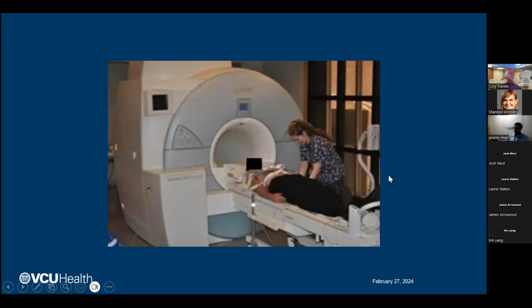And this goes for a number of things. I mean, not just CMR, but transthoracic echocardiography, right heart catheterization, all these things where traditionally the measurements have been made at rest. And I think what's become clear with other modalities, including right heart catheterization, is that you can fail to uncover certain pathologies like elevated filling pressures at rest alone in at least a subset of individuals.